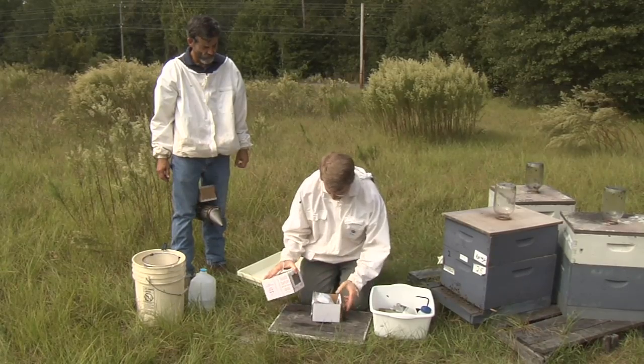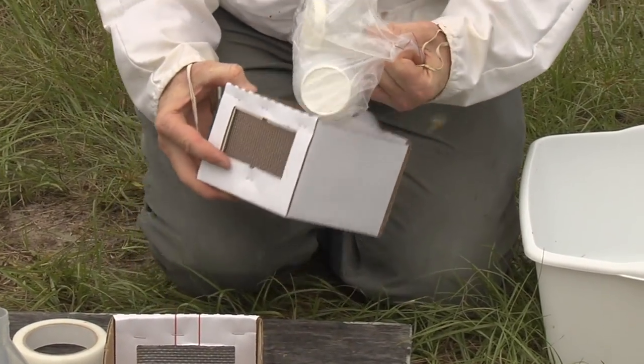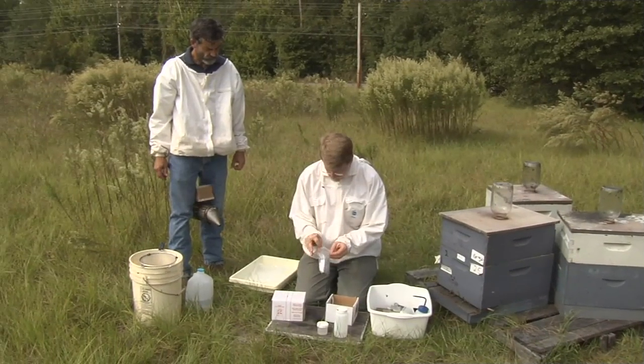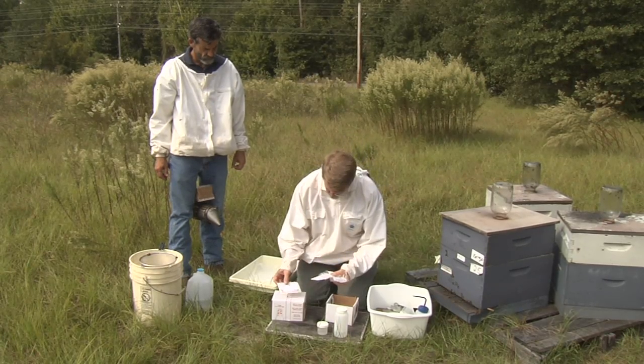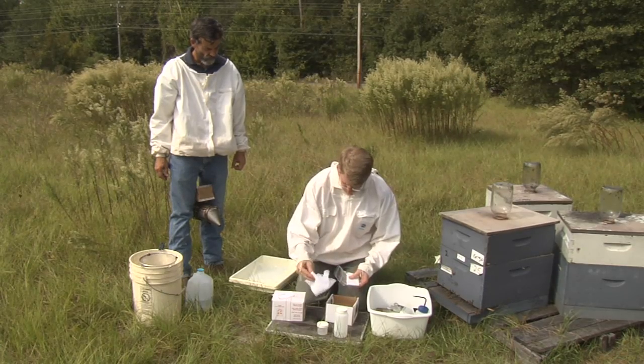Open one live bee mailing box. It should contain a Ziploc bag with one large bottle and one small bottle of alcohol. Another Ziploc bag contains a data collection sheet, ID stickers, mailing labels, a stamp, and a nylon filter.